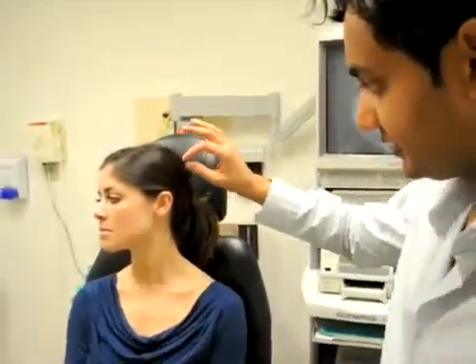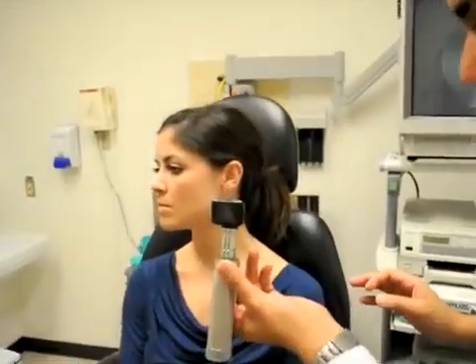So we'll now talk about the examination of the external auditory canal, the tympanic membrane, and the middle ear space. When we're examining these structures, we use an instrument called an otoscope.